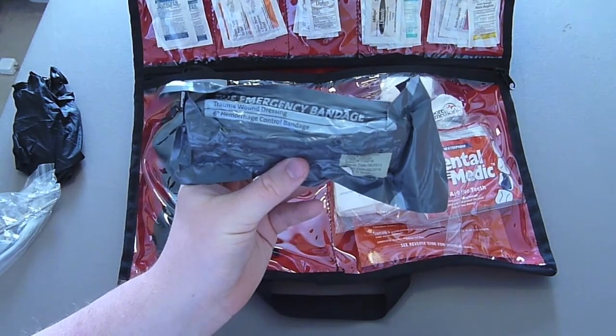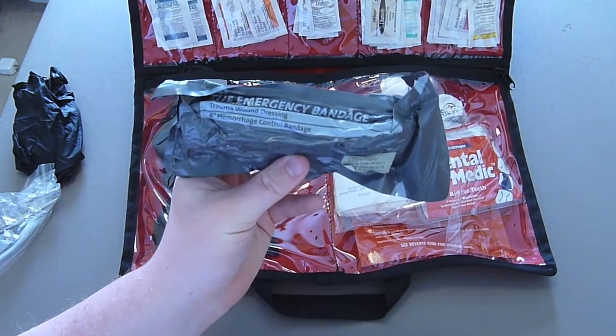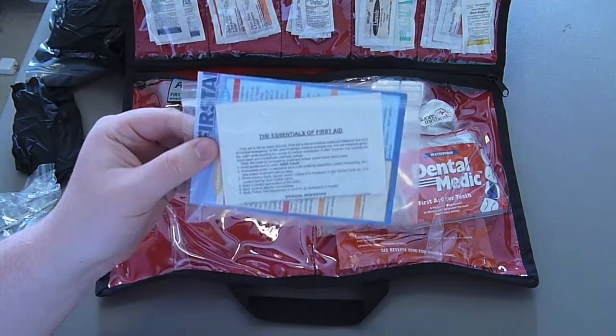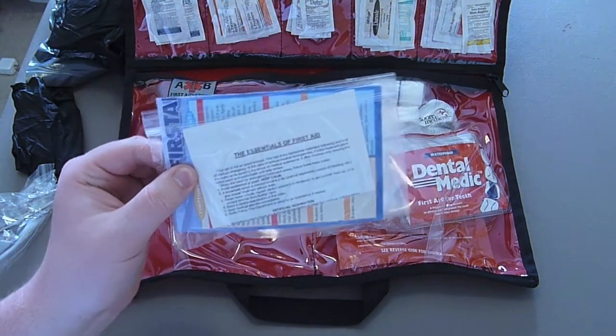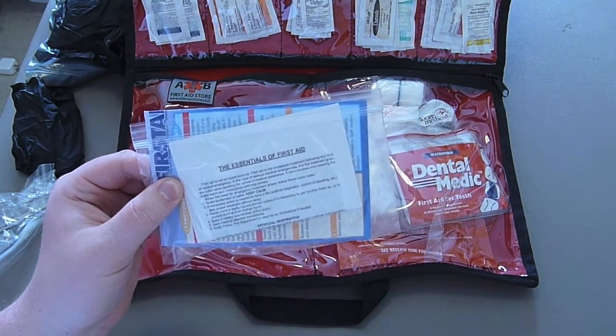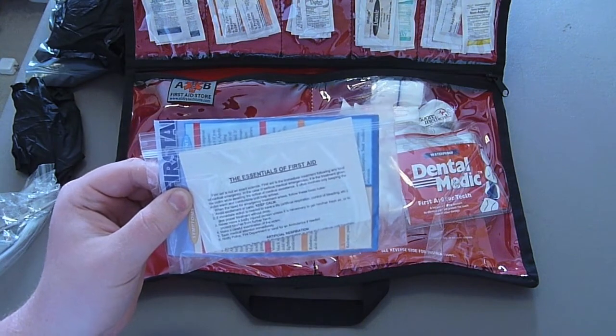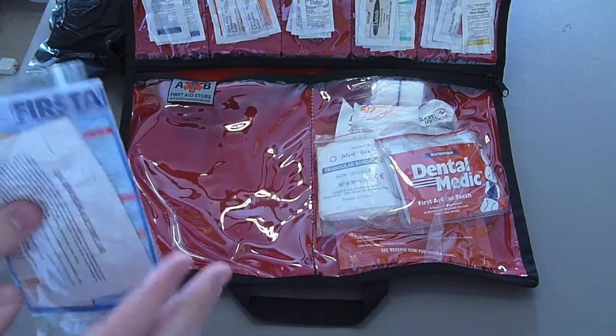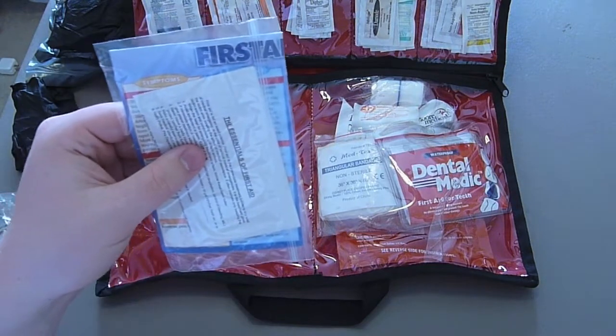I have an emergency trauma wound dressing called the emergency bandage. Here we have more pairs of gloves — I like to carry multiple pairs. Let's say somebody gets a hold of this kit and maybe they don't know how to use anything inside, or maybe I'm just freaking out and don't remember what to do. I also keep some quick instructions and a very colorful chart with symptoms and treatments.